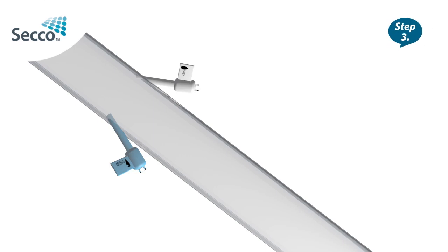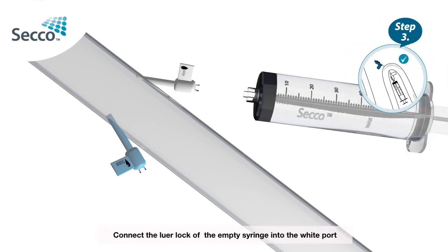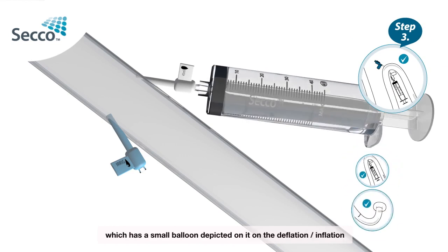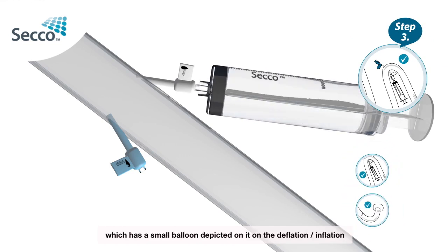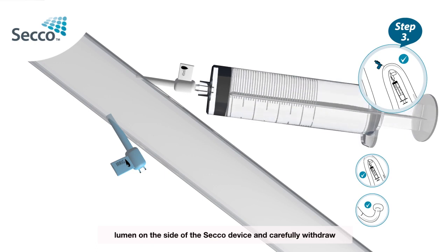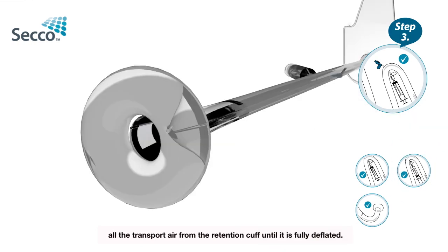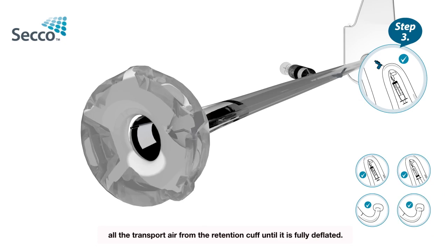Step 3: Connect the luer lock of the empty syringe into the white port, which has a small balloon depicted on it, on the deflation-inflation lumen on the side of the Secco device, and carefully withdraw all the transport air from the retention cuff until it is fully deflated.